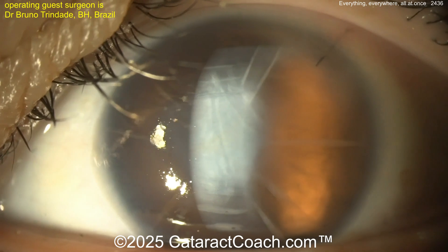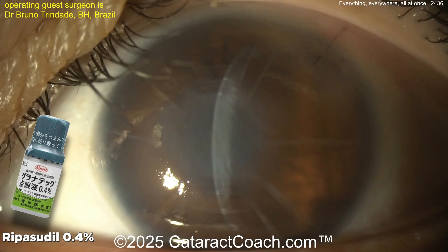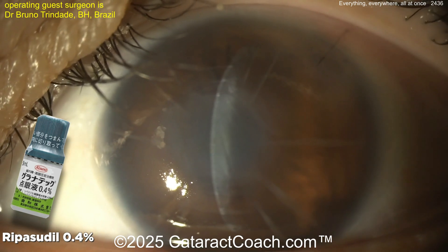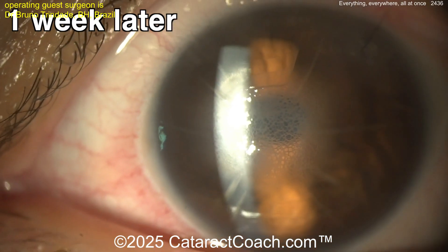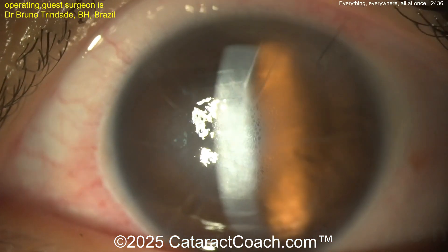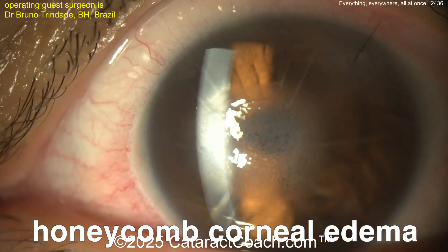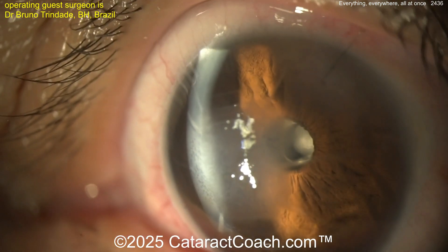Post-op day one: there's some central corneal edema here — that's okay, we're going to be patient and let this heal up. Using some ripasudil to help the endothelial cells migrate to the center. A week later, look — you've got the characteristic honeycomb corneal edema centrally.